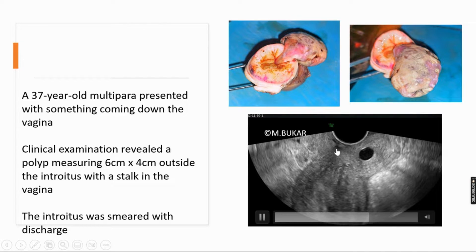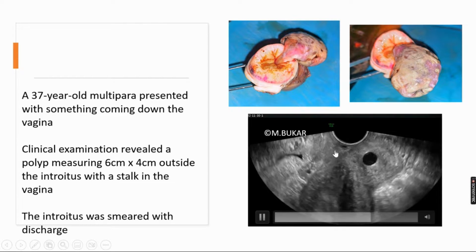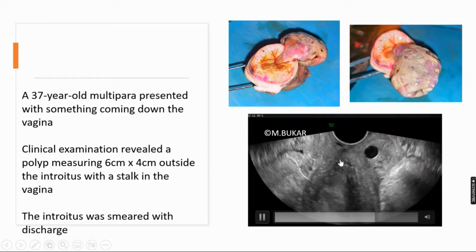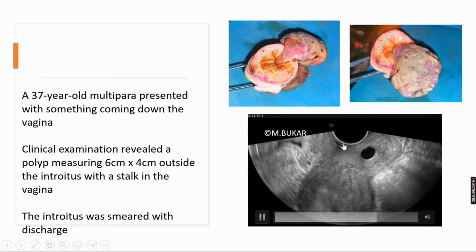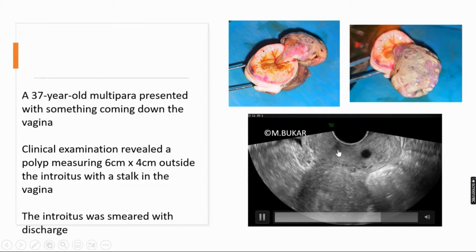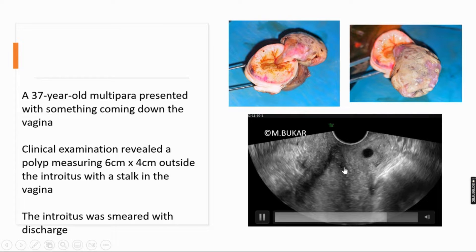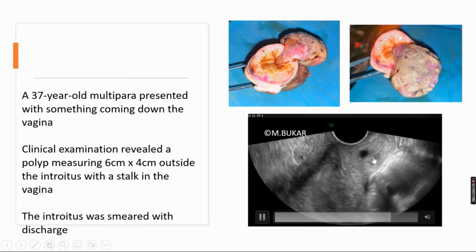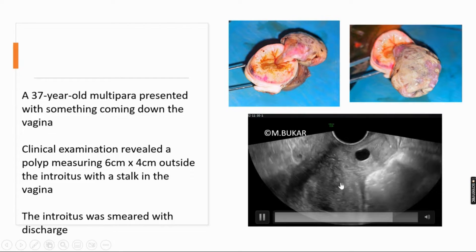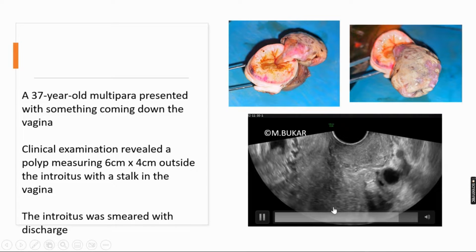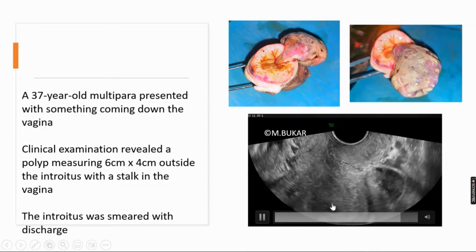This is the pedicle of the polyp in the cervical canal. This is an ovarian follicle — note the fluid in the endometrial cavity.